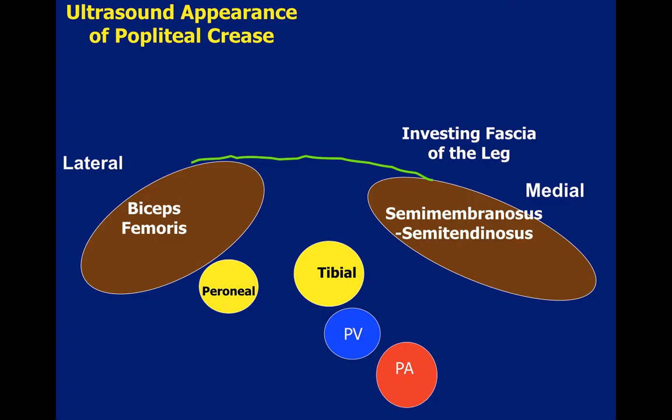In some cases, it is beneficial to perform the popliteal fossa injection distal to the bifurcation of the sciatic nerve. It has been suggested that the onset of local anesthetic effect is more rapid when injection is performed at the level of the tibial and peroneal nerves. This may result from the smaller calibers of these individual nerves relative to the larger caliber of the sciatic nerve. As with other nerve blocks, the technique of positioning the needle tip in contact with or in immediate proximity to the nerve may result in patient discomfort or injury.